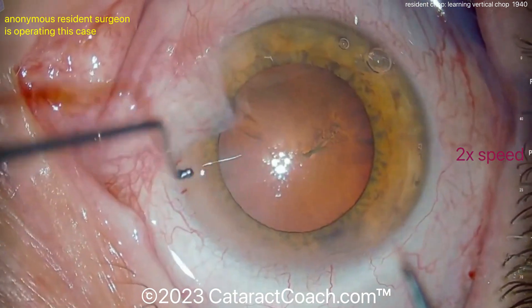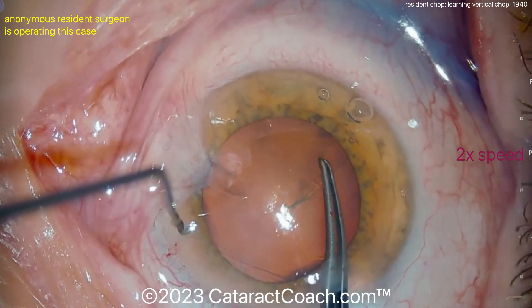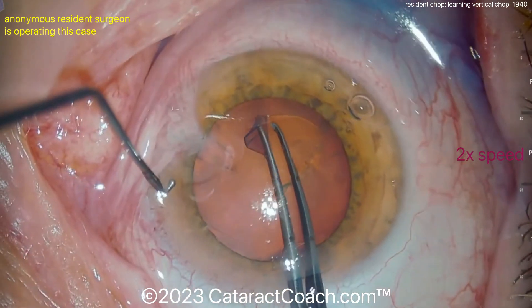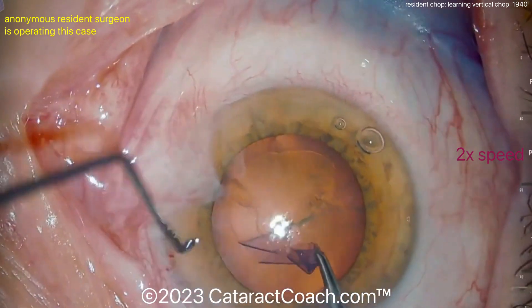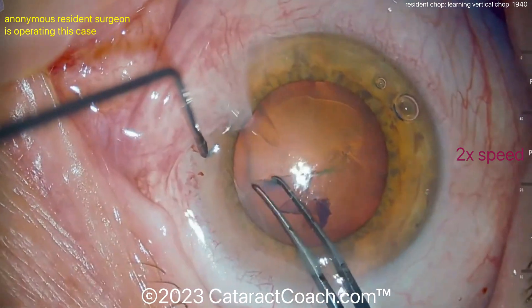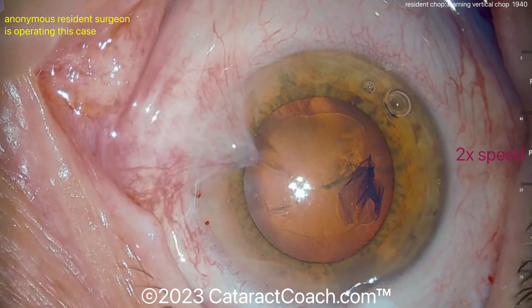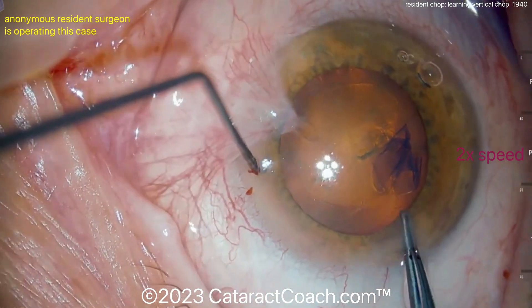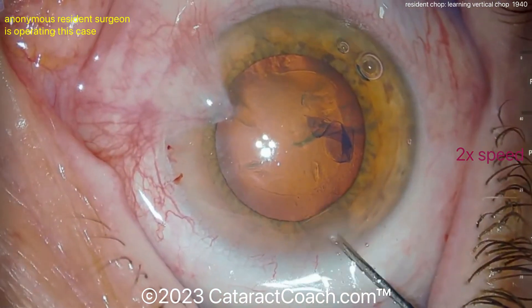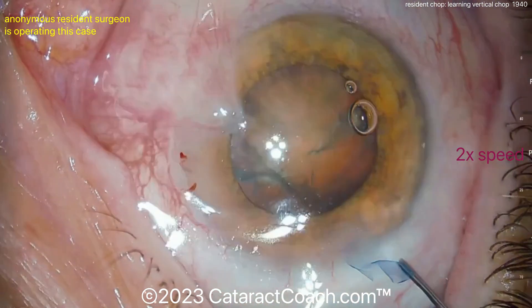Starting the rhexis here with a cystotome and now fixating the eye. The rhexis is going around — so far, so good. When you're a young doctor, the trypan blue dye can certainly help you visualize the capsule rhexis, but keep in mind it can make the capsule a little bit less elastic. It looks like a reasonable rhexis. There's a completed rhexis, probably close to five millimeters, with some hydrodissection here.